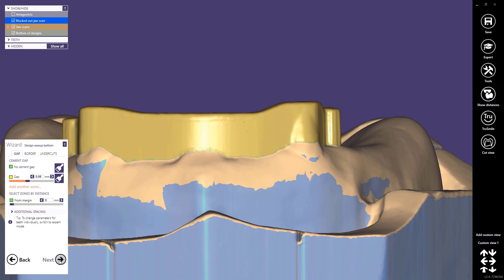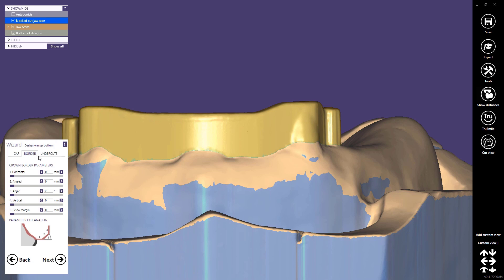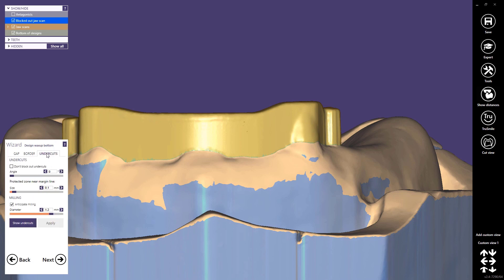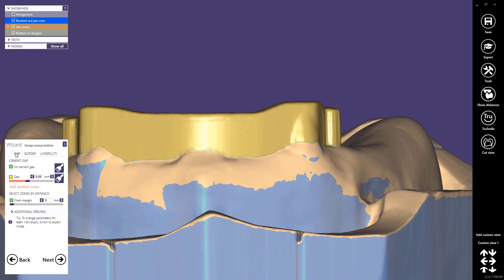In the next step we can define the gap between the offset substructure and the bar. This is a quite crucial parameter, so please discuss it with your milling partner. We can also change the border properties and the undercut. There is no need to change this parameter now, so please press next to go to the next design step.